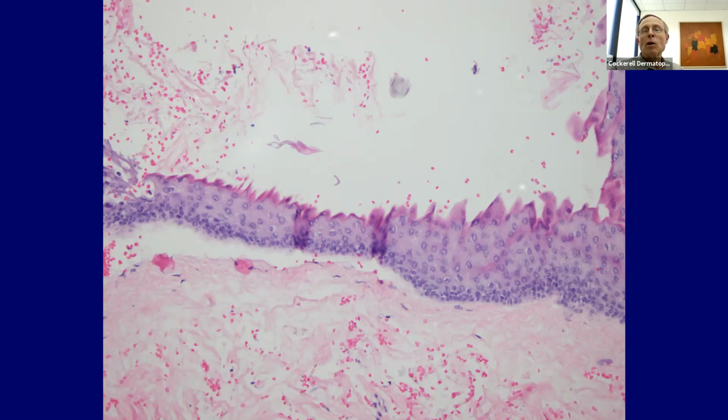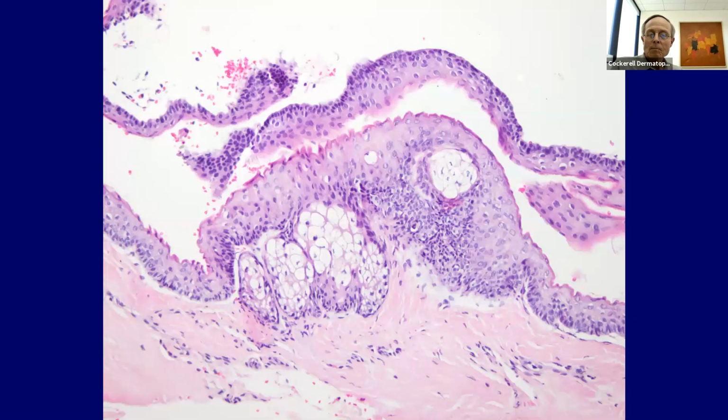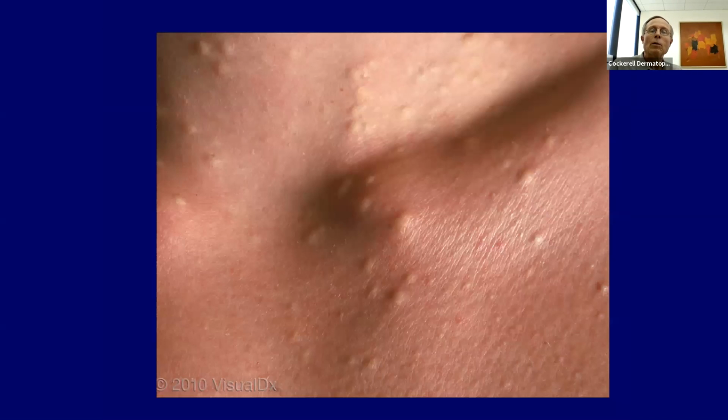But again, in dermoid, you're looking for hair shafts, sometimes even weird stuff like teeth. So in dermoid cysts, look for other structures than just lining. But you can get a little bit of the corrugated membrane with that too, just not as prominent as here. So they might ask you some questions about this also. Now I'd still call it a Steatocystoma probably, but if you want to call it a sebaceous duct cyst, you can, but that's not going to be an option on the board. They won't have that on there.